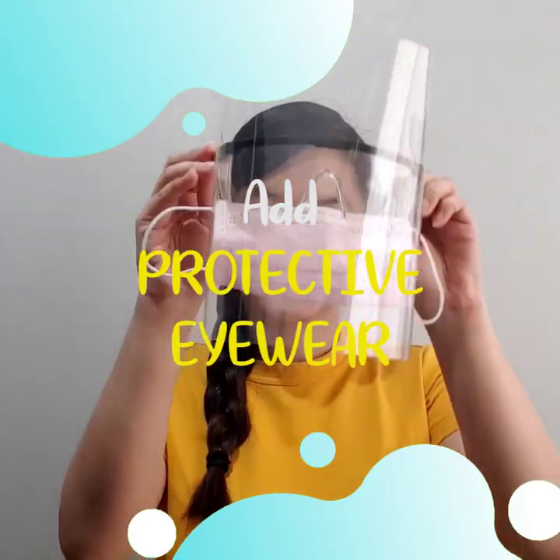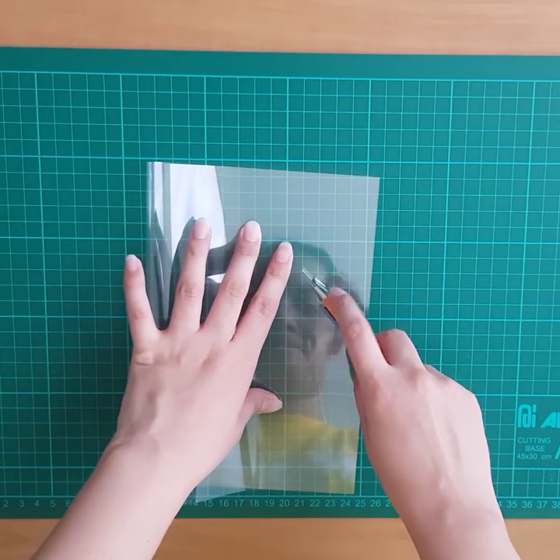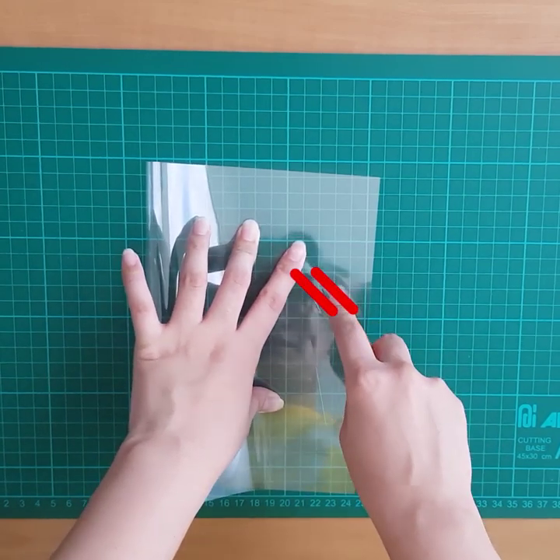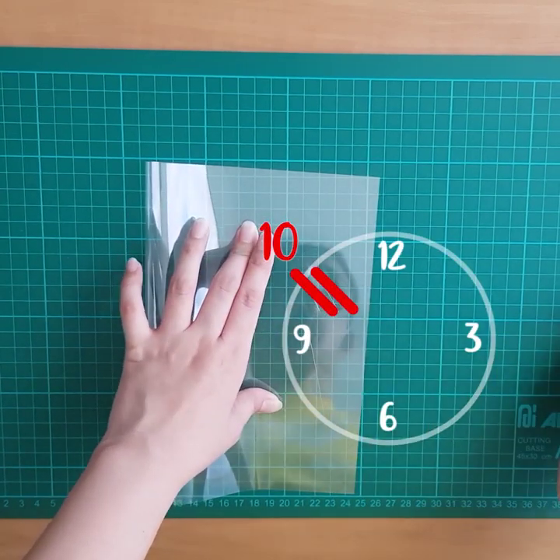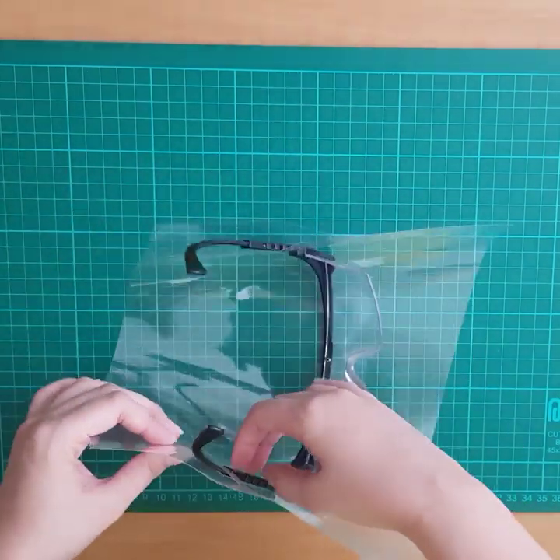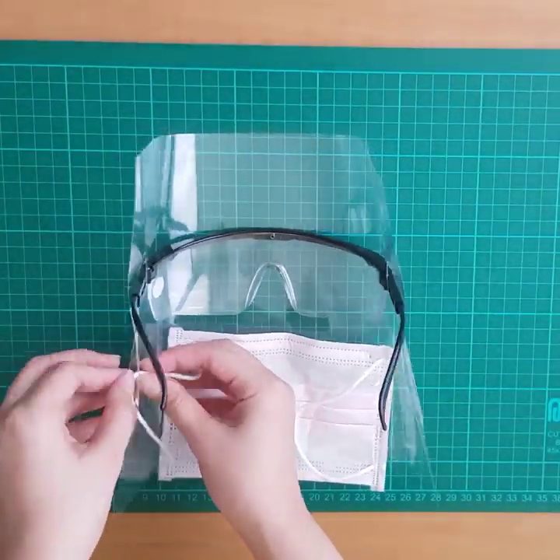You can add protective eyewear to the face shield by doing the following. After making the slit for the mask, make 2 short cuts above it at a 10 o'clock angle. With your glasses facing down, thread it through the slits on either side so that they're securely in place. Thread the mask into the slots as normal and wear it.